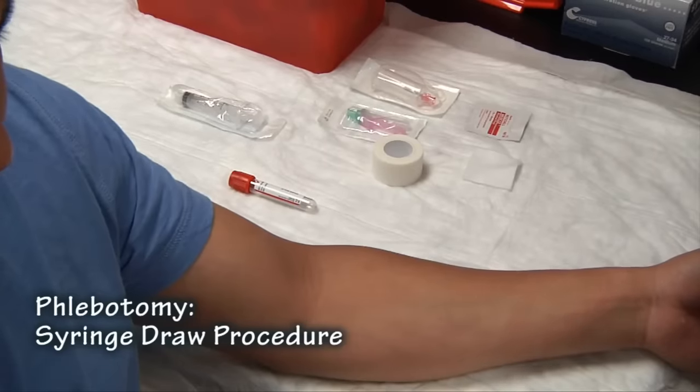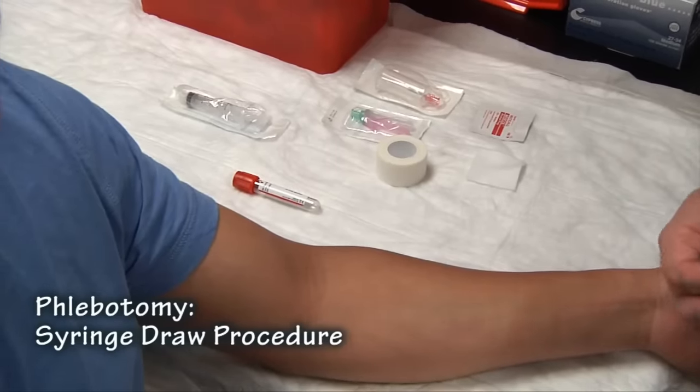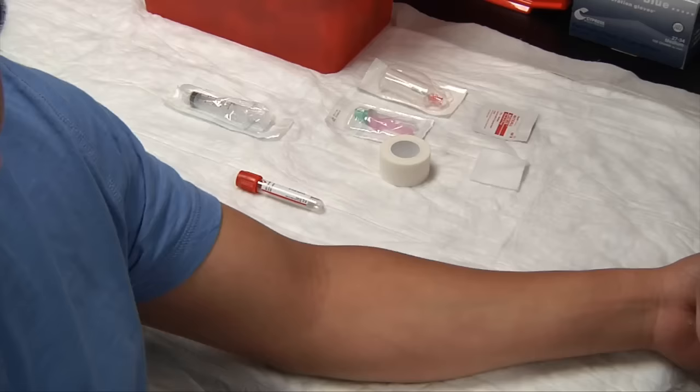Today we're going to learn how to do a syringe draw. Sometimes we need to do this for patients whose veins cannot handle the pressure of the vacuumized tubes.